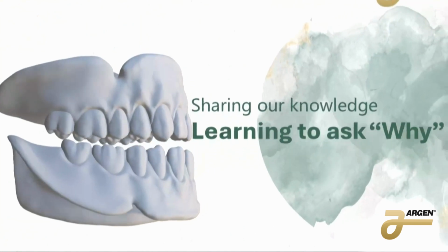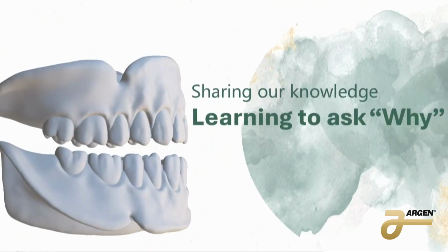Let's get into it. One of the most important lessons I learned from coming from a large lab setting and then working with a denturist for a while, going fully digital, is the question why. Why do we do it this way? If you're in a lab and you ask, why are we doing it this way? The answer is usually, we've always done it this way. And then you just move on with your workflow. And I don't accept that answer.